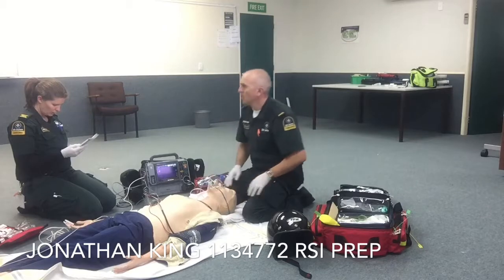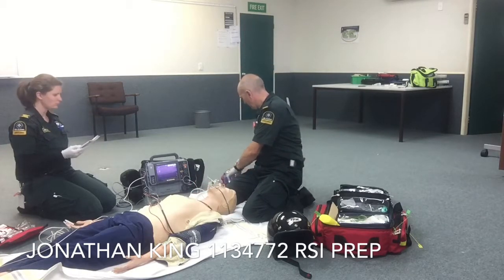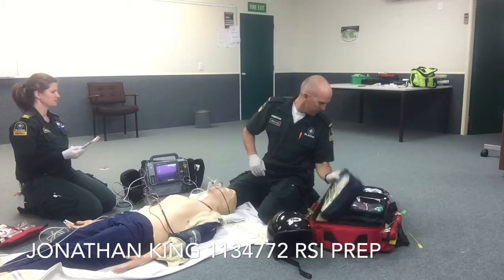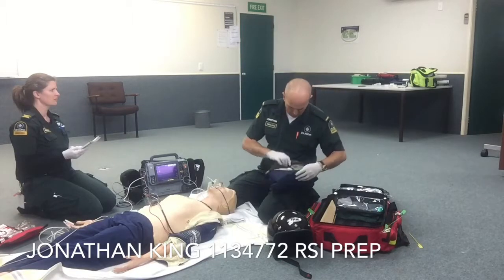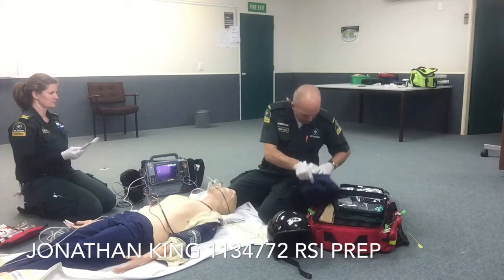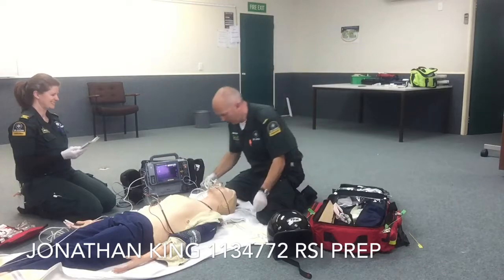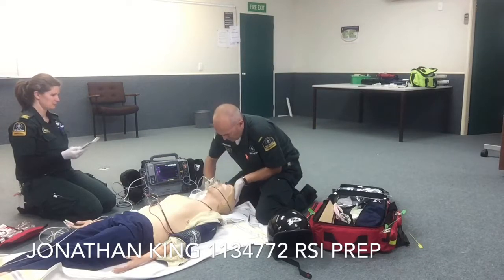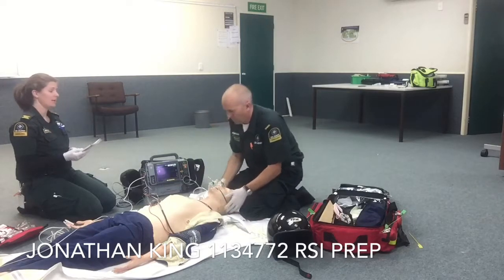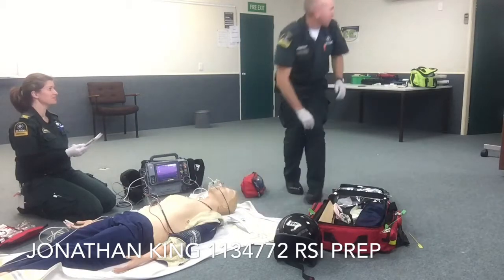Place an ETT holder with the strap undone under the patient's head. Prepared earlier. Okay. Ensure suction is working and turn it on. Suction, yep.